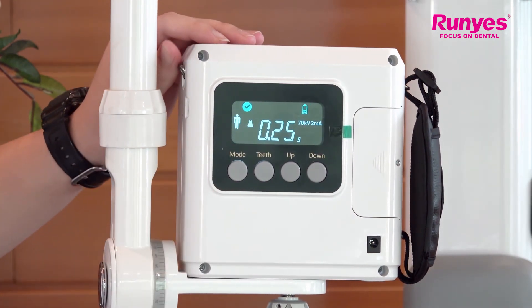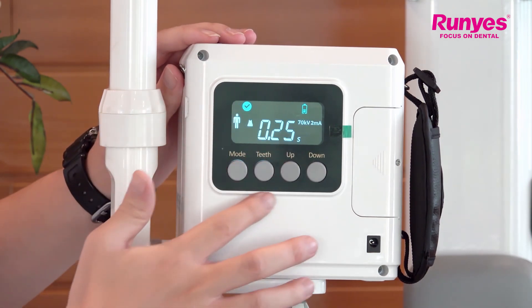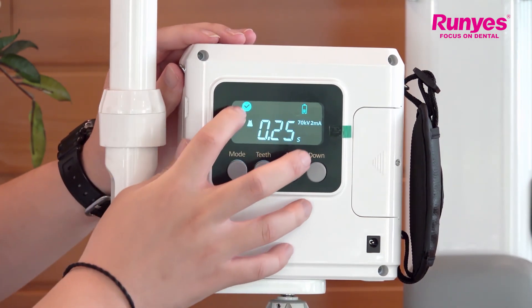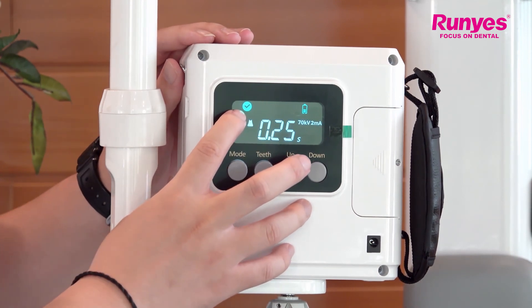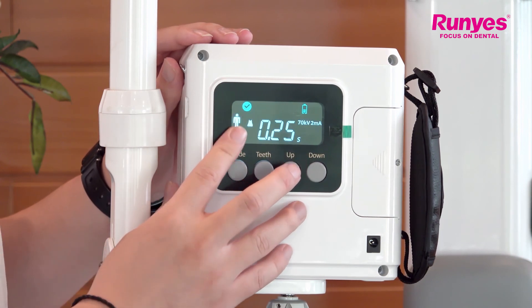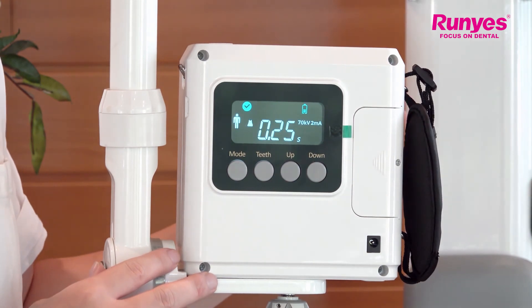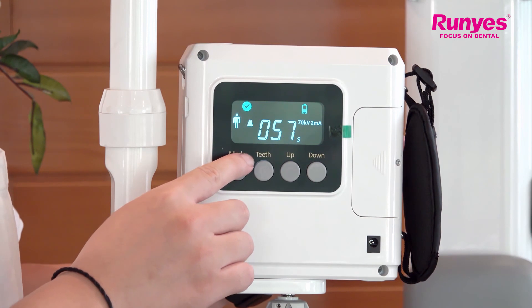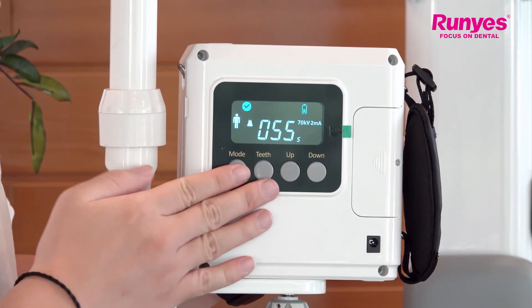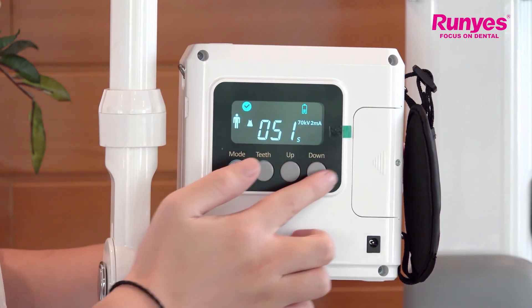Now I will show you how to expose. When the check icon lights up on the screen, that means the system is ready for exposure. Press the exposure button once — a 60-second countdown will show up on the screen. During this period, if you want to cancel the exposure, you can press any one of these four function keys.